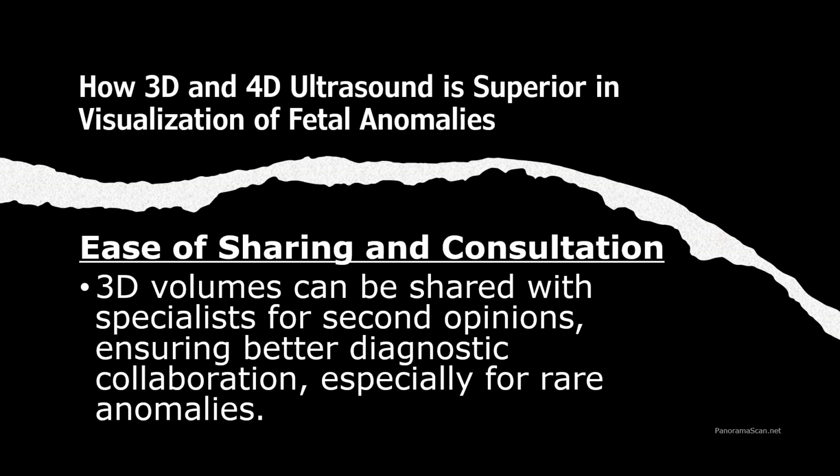This is particularly beneficial for diagnosing rare anomalies where specialized knowledge may be required.